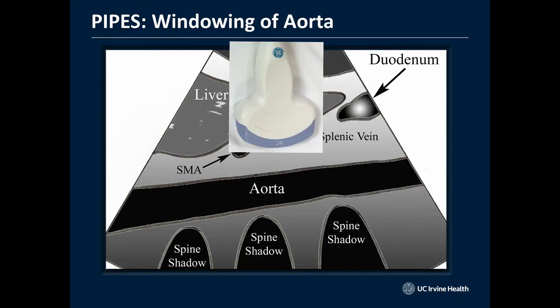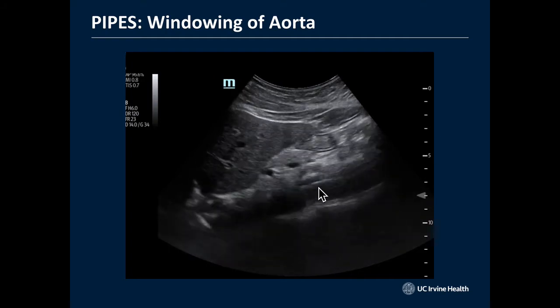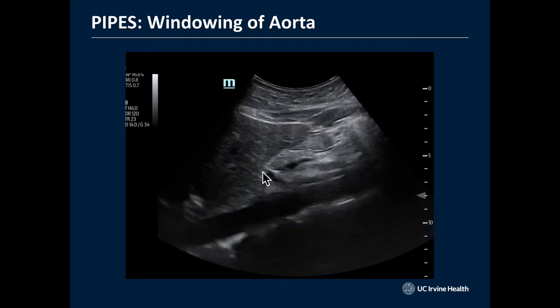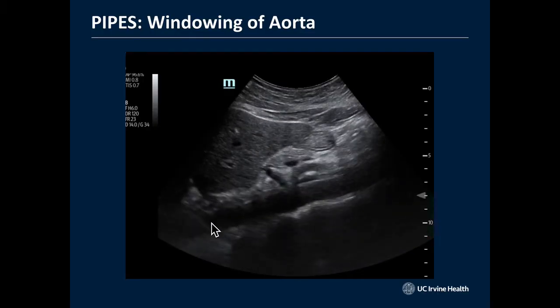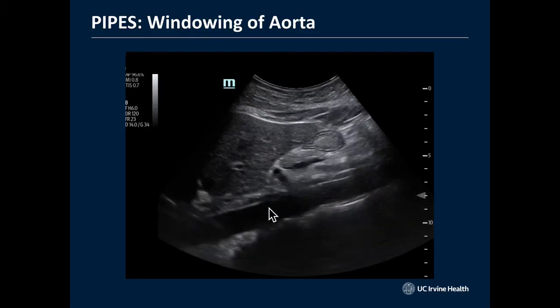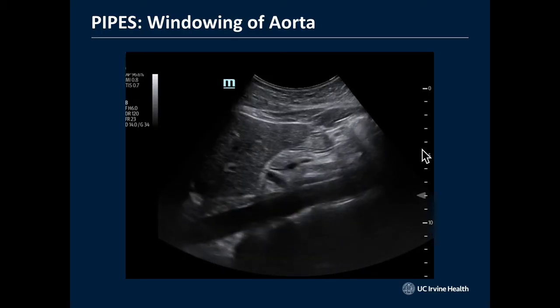And so you take that curvilinear probe and you just plop it down the aorta. You could do it in both the transverse and the sagittal plane. And you're going to see as the vertebral bodies get larger and larger and larger, the aorta kind of gets a little bit more anterior or superficial. And we can see it here. Here's the aorta stretching out across the screen here. We see the liver up here. This is the duodenum. Getting distracted by all these cool vessels. Here's the celiac and the SMA. But this is a normal looking aorta, just kind of pulsating along here in this normal person.